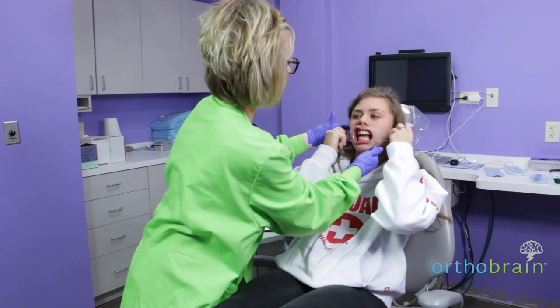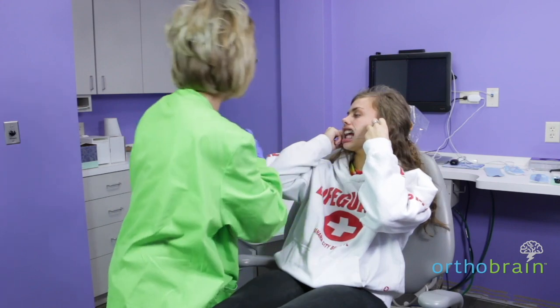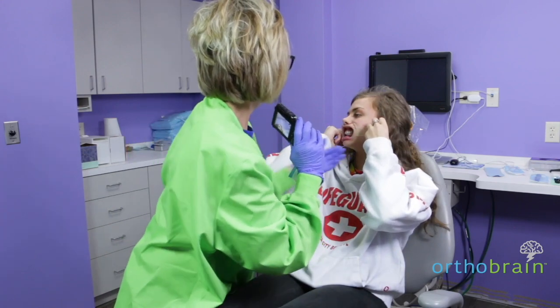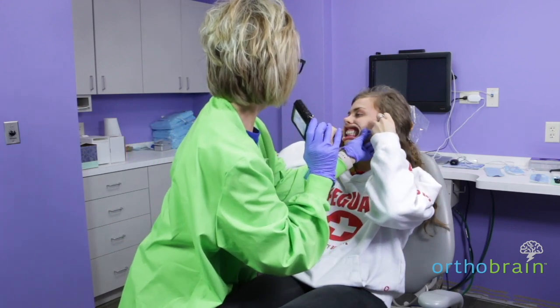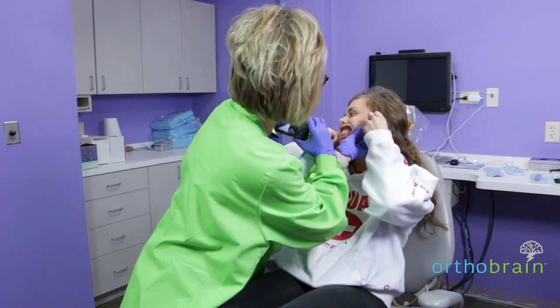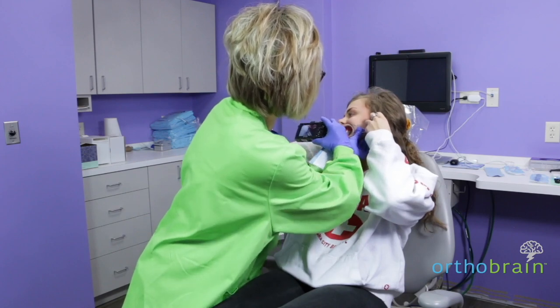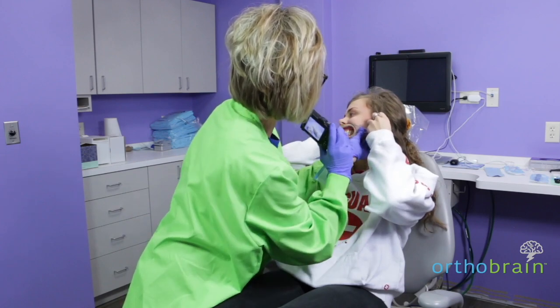Now you're going to turn all the way around that way. Bite down. We're going to pull really back on this one, and if you can turn just a little bit more. Same thing — you want to see half of the central and at least the first cusp of the first molar.